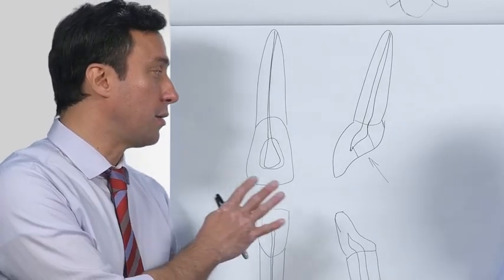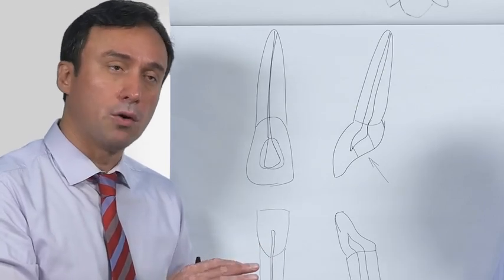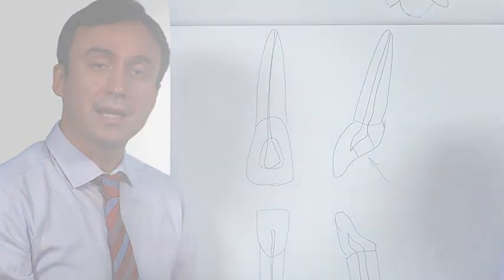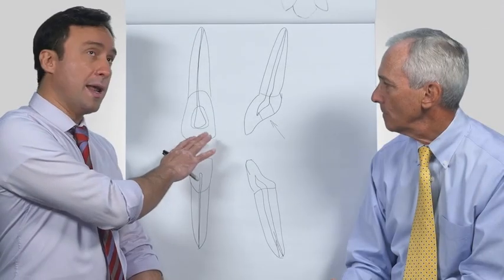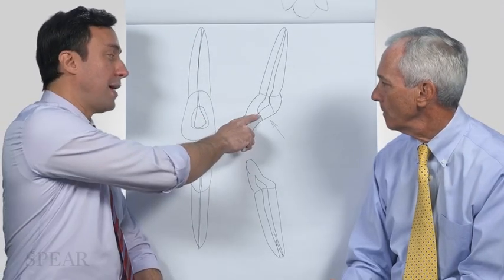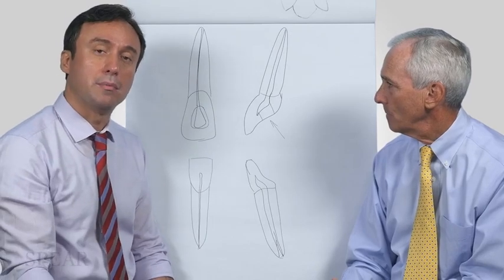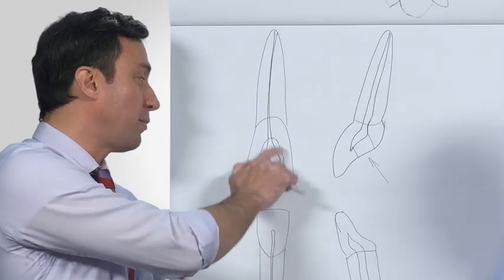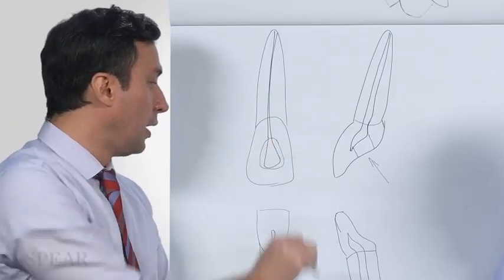And if you're thinking that you're preserving tooth structure but making it oval, you may be preserving a quarter of a millimeter of dentin or so here and there, and enamel. But what you're missing is a rim of bacteria that would be persisting, and that's certainly not helping anybody. So that's important to keep in mind. You're right, a kind of heart-shaped or that kind of an oval.